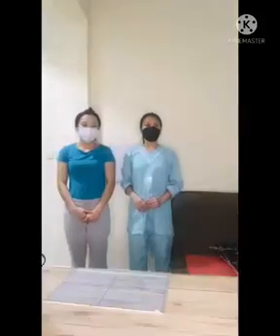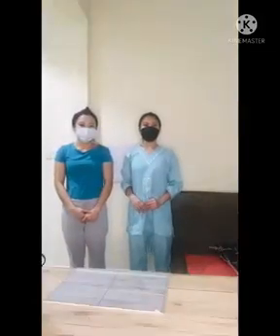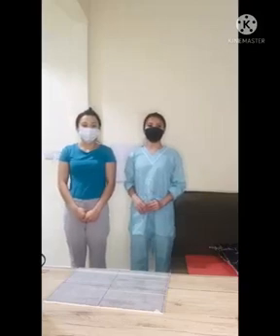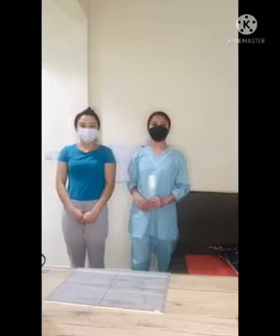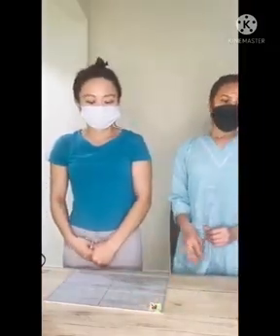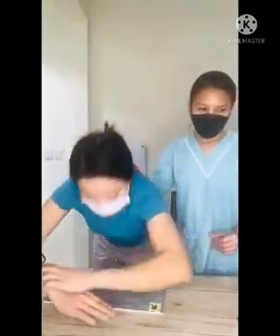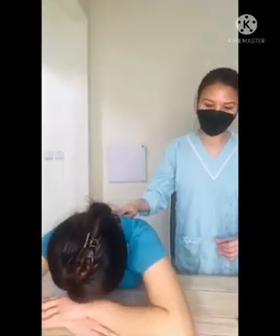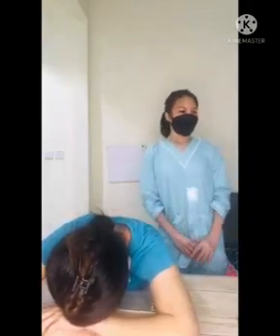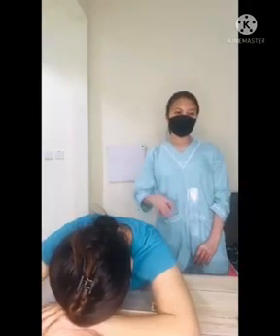Next is the sternum PA oblique projection, Moore method, modified prone position. We're going to instruct the patient to stand at the side of the radiographic table, bend at the waist, and place the sternum at the center of the IR.